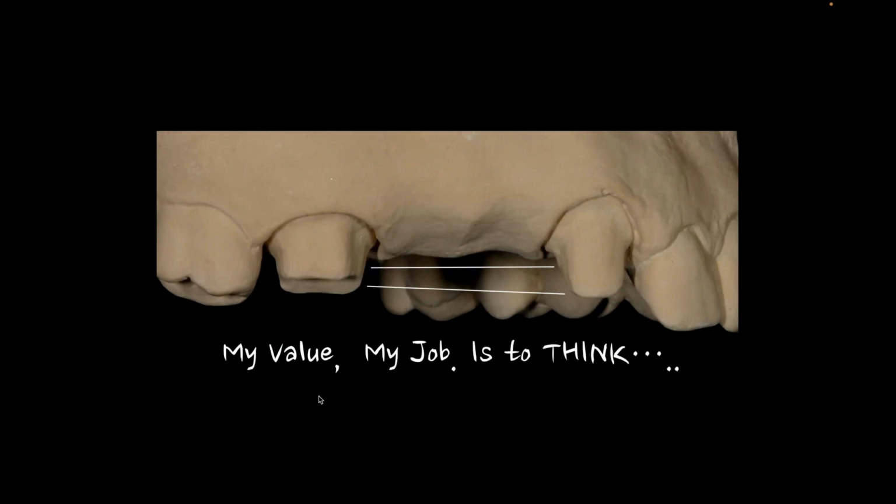Perfect example. Here's a 4-unit bridge. If I scan this and put it into a digital world, I pick the material. And once I pick the zirconia, it will tell me the parameters of what I can and can't do. What do I mean by that? It'll say, you need to thicken up your connector here, because the machinery knows it has to be 4 square millimeters. What it won't tell you is that when you make that connector 4 square millimeters, you lost the ability to create an embrasure space, or you lost the ability to make the tooth in the proper position functionally. And that's our part, right?